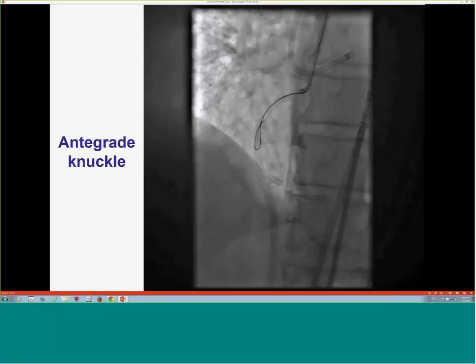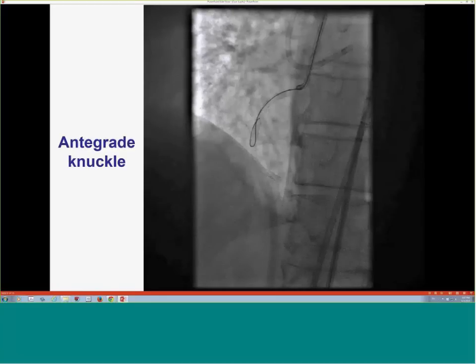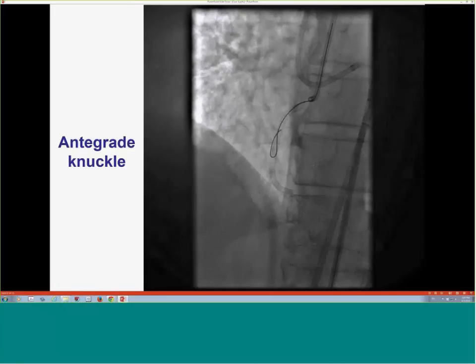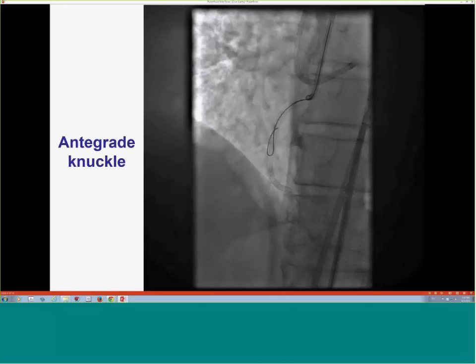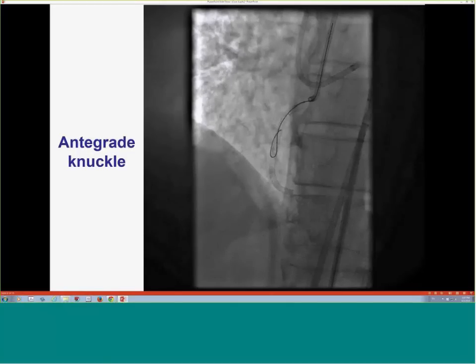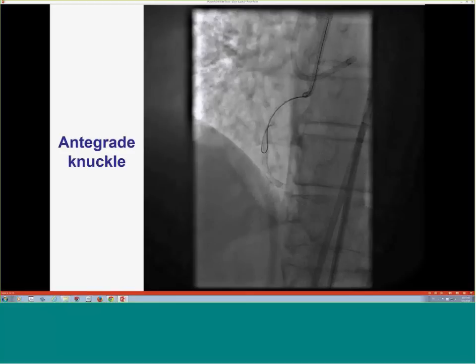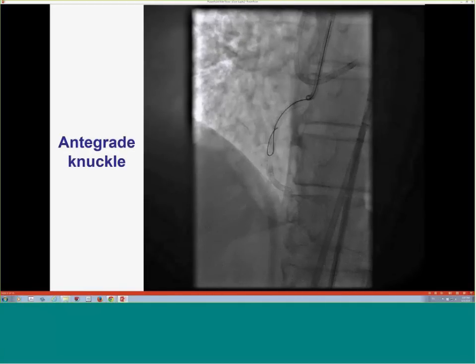And before I go there, we tried, I mean, literally for a long time, trying to get some sort of wire, Confianza Pro 12, we got the Gaia guide wire, we tried to get some entry into the stent, but I think once we got the exit into this subintimal space, then everything tended to actually follow this path. So unfortunately, we were unable to get a wire in. So I wonder how many people would just keep on going or just try to do something different at this point.